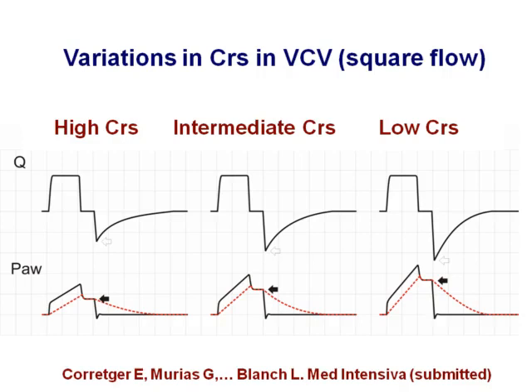So, what to monitor? This is the main aspect of my talk. Initially you have the patient intubated, so what are we dealing with? Again, we need to look at two important things when we are at the bedside, two important waveforms: the airflow as a function of time, and pressure. Then, depending on the mode, we will know all this. Maybe this is the basics, but I would like to explain this.